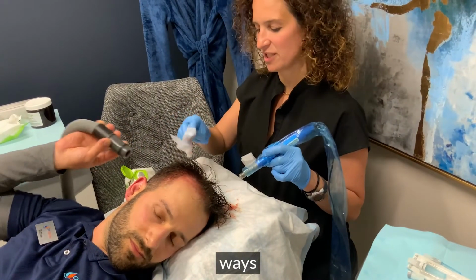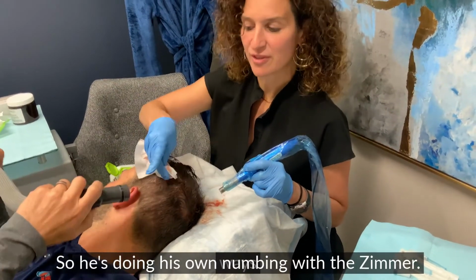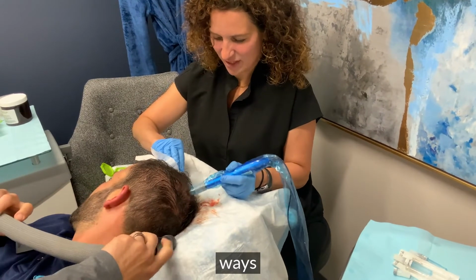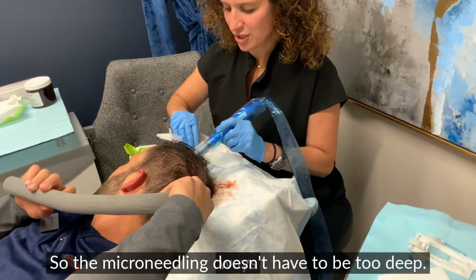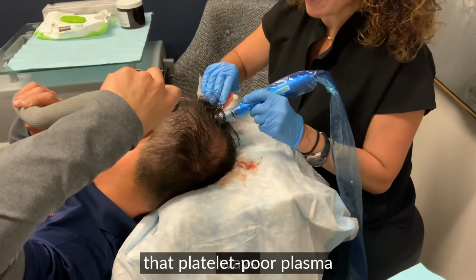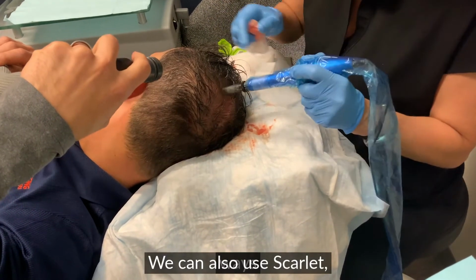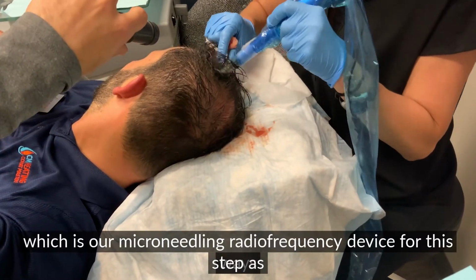Right? Turn your head to the other side for me. And now I've started putting him to work, so he's doing his own numbing with the Zimmer. Sometimes it's good because then you can distract a little bit. For sure. Yeah. So now we're going to microneedle. You're going to come up here. Bring your head up. There you go. Right. The microneedling doesn't have to be too deep. It's just to help, again, stimulate those hair follicles and get some of that platelet-poor plasma into the tissue. We can also use Scarlet, which is our microneedling radio frequency device, for this step as well.